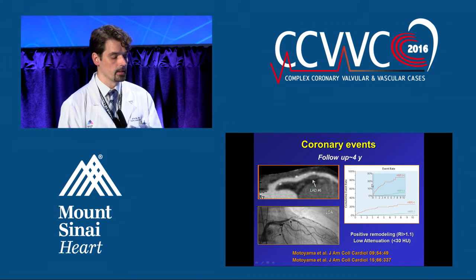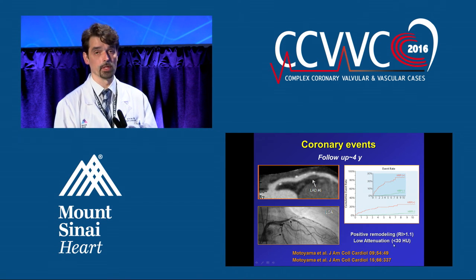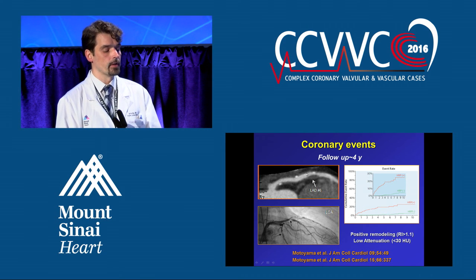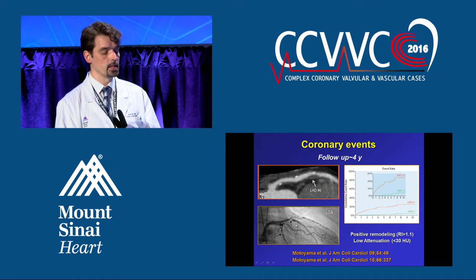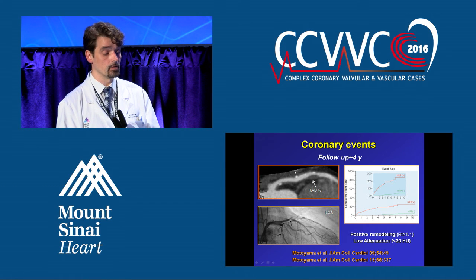There's a very interesting study led by Dr. Narula here, and there are now 2 publications with a follow-up to 4 years. What they basically looked at is that the patients had CTs, they identified plaques, and they considered them high risk if they had either positive remodeling or low attenuation, less than 30 Hounsfield units, as I said. So they followed these patients, and some of them developed events, and they could see in the cath which plaque had created the event. So actually, these particular plaques, when they had these features, were associated with many more events than the plaques that did not have those. So it suggests that in finding these features in the CT angio, you can predict who is at higher risk, whereas stenotic lesions that don't have those features may not be as risky as we think.